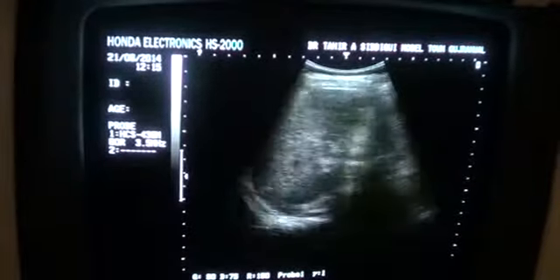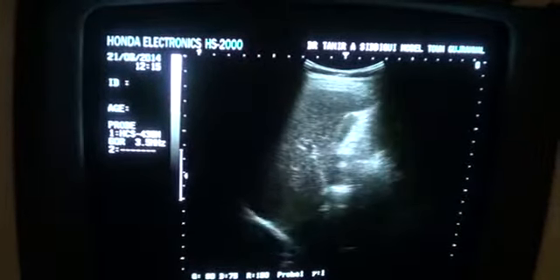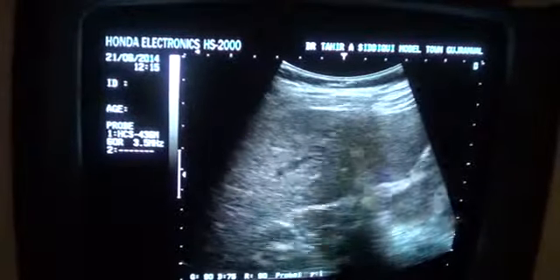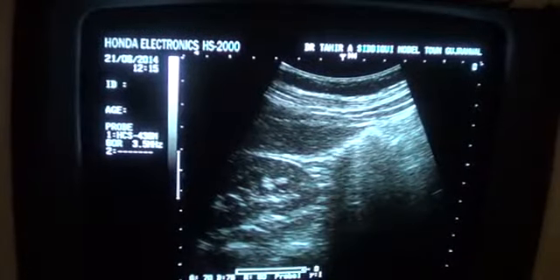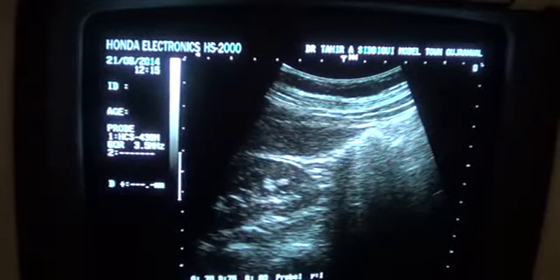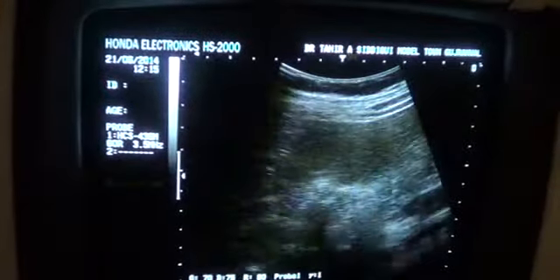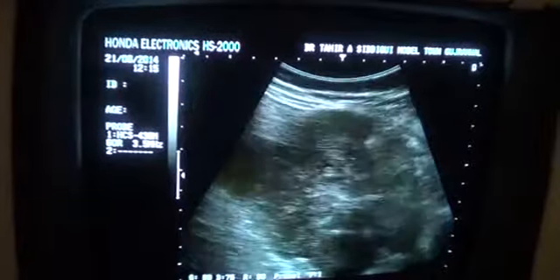Now where is the gallbladder? Yeah, here it is. So the mass does not relate to the gallbladder, to the liver, to the kidney, and this is the lower pole of the right kidney. It's not relating to the lower pole of the right kidney. This is the liver angle, and from here we can trace the mass.